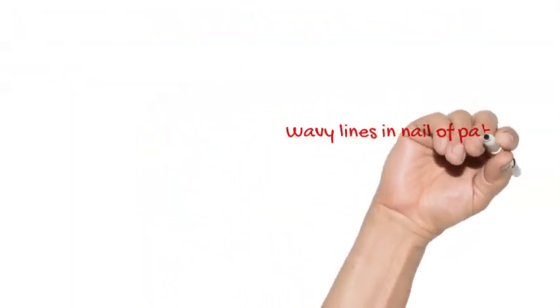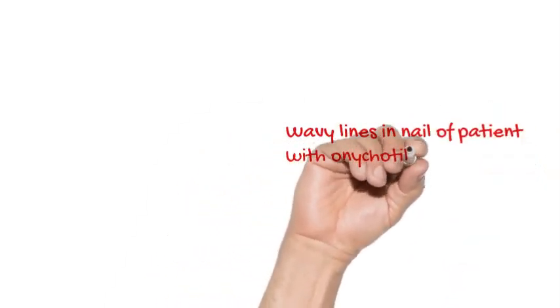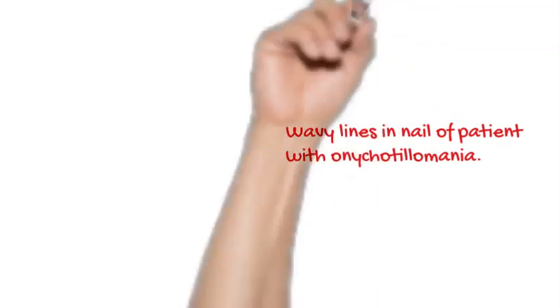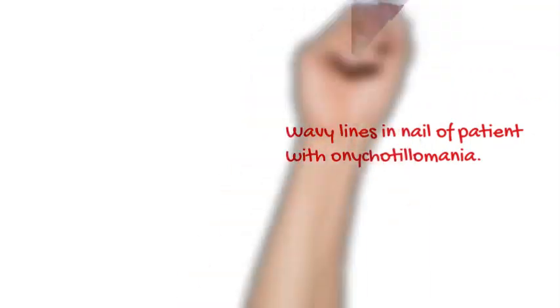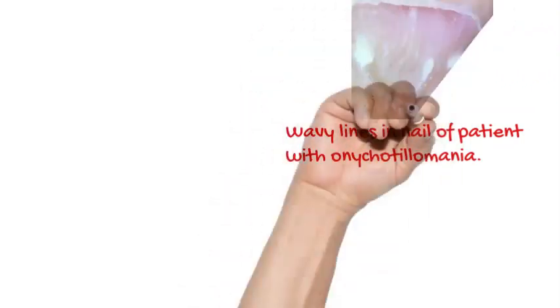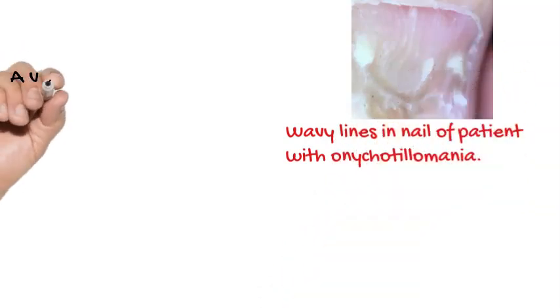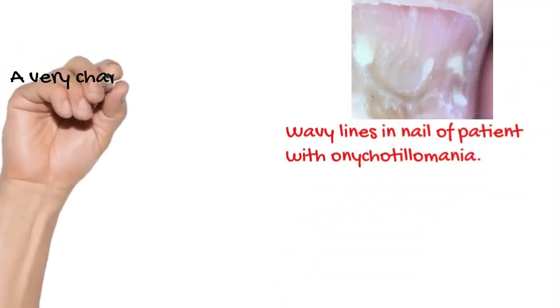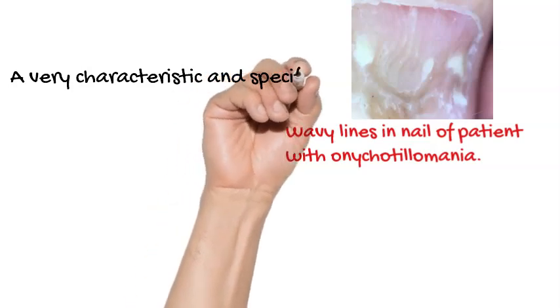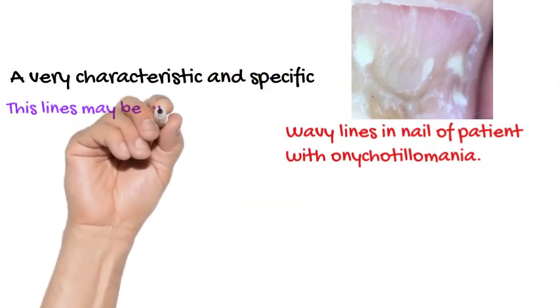Scales and absence of the nail plate are related to the traumatic criteria of onychotillomania. As we see in this photo, these are wavy lines in the nail of a patient with onychotillomania — a very characteristic and specific feature.